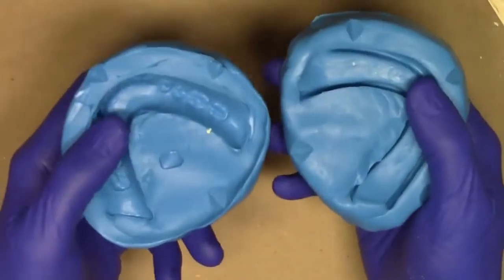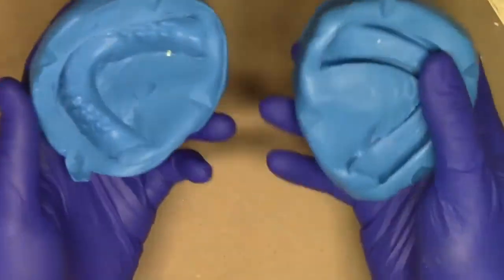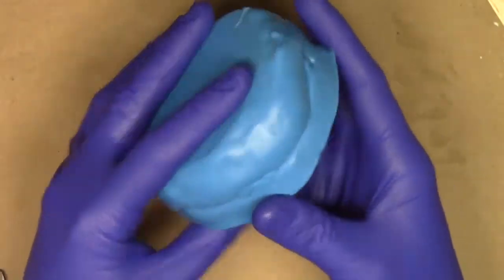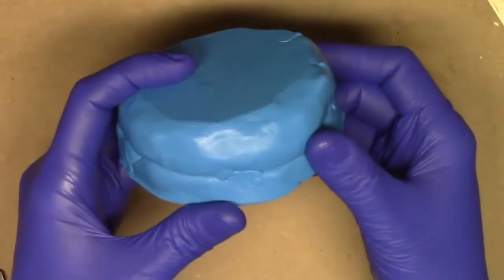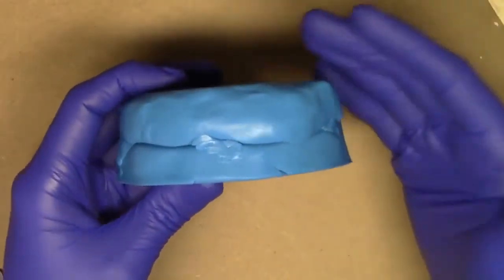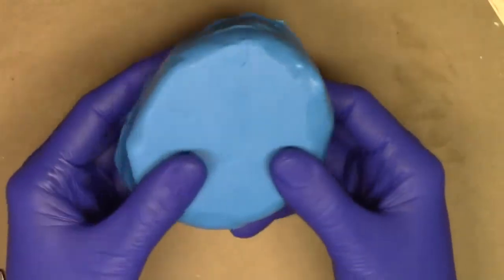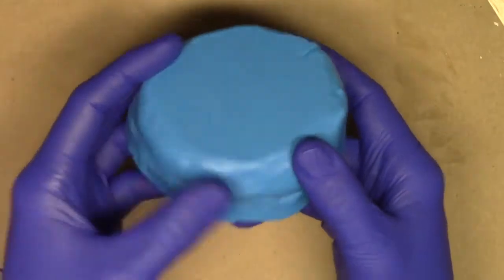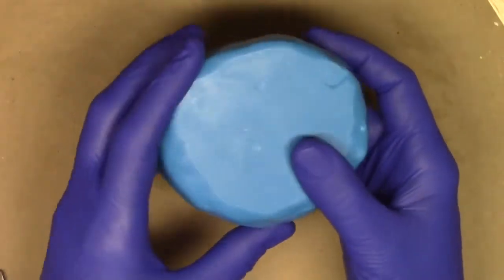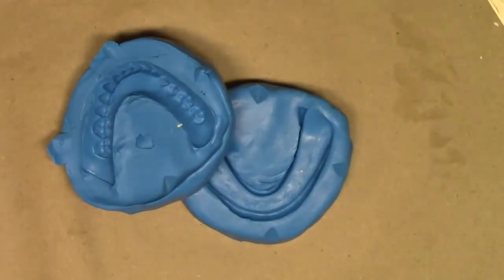What we do is we utilize this putty duplicate and we pour in a clear orthodontic resin into this space and into this space, sealing it together and cooking it just like so. This can be done by yourself, a clinician, or it can be done by your dental assistant, or alternatively you can send this to the laboratory technician where he or she can do this in a laboratory controlled environment. I prefer to do this technique in this procedure by myself within my own office just because it's pretty simple and pretty effective time-wise for me to do.